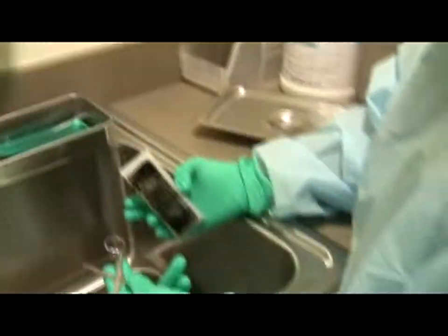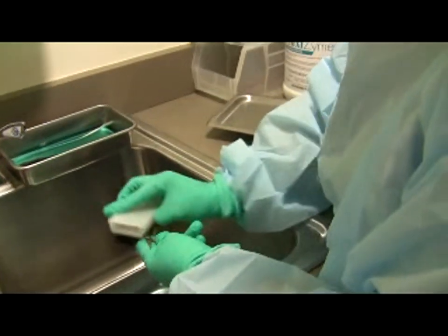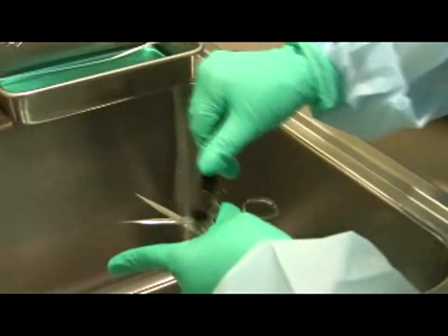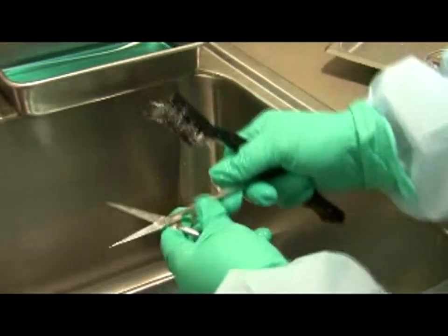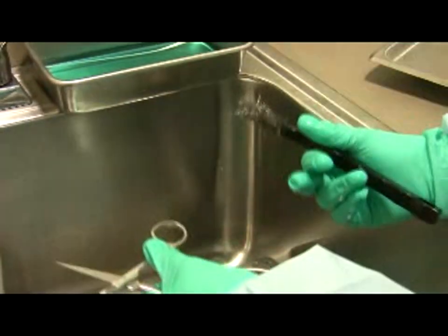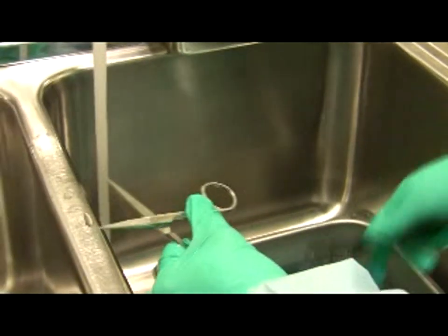You also have to put the instruments in the ultrasonic cleaner. When cleaning scissors, hold them with the points away from you and scrub. If there's dried blood, use the metal bristle brush — be aware you can get stuck with the brush or the scissors themselves. Hold the hinged instruments so the sharp end is always away from you, sturdy them so they're not waving, and scrub from the hinge going away — never scrub towards your hand.